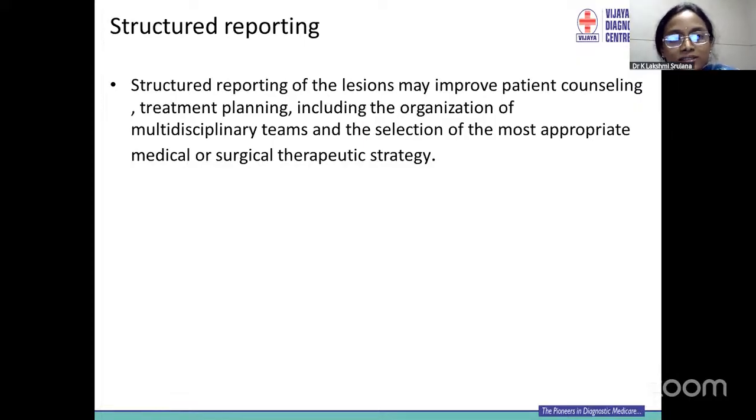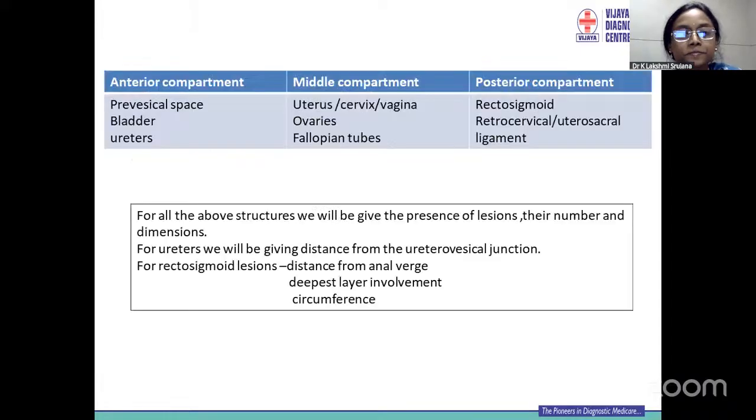Last but not the least, I want to give a small gist on the structured reporting of these lesions, because it may improve the patient counseling, treatment planning, including the organization of multidisciplinary teams and selection of appropriate medical and surgical therapeutic strategy.